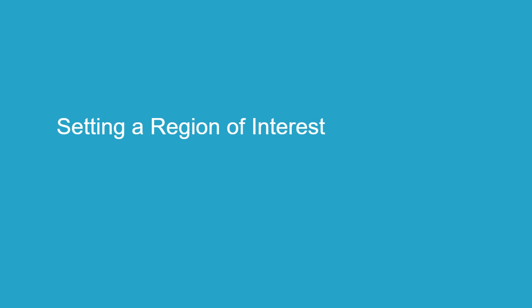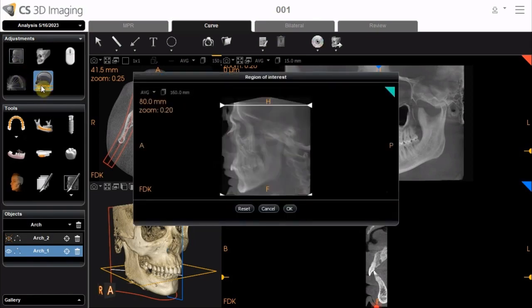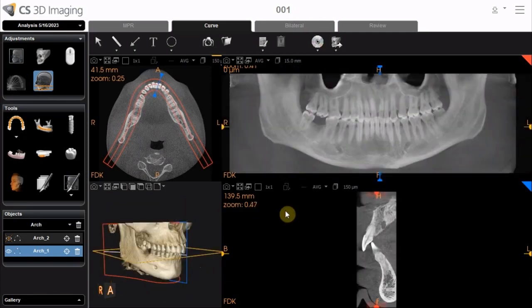Setting a Region of Interest. In the Adjustments Pane Toolbox, select the Basic Region of Interest tool. The Region of Interest window appears. Use the white horizontal lines to define the upper and lower limits for the region of interest. Click OK. Now, the reconstructed panoramic, oblique, and coronal images are cropped to the limits set in the Basic Region of Interest tool.